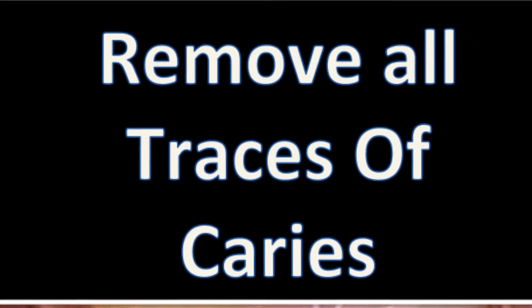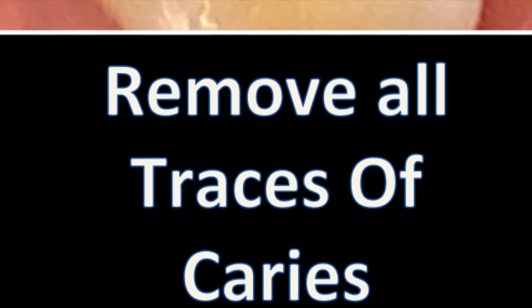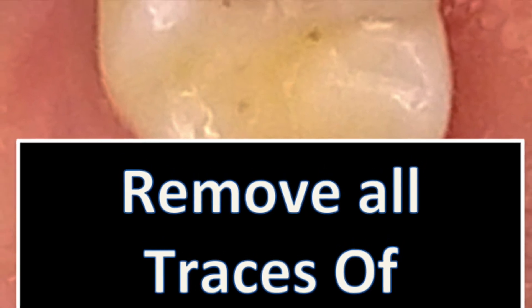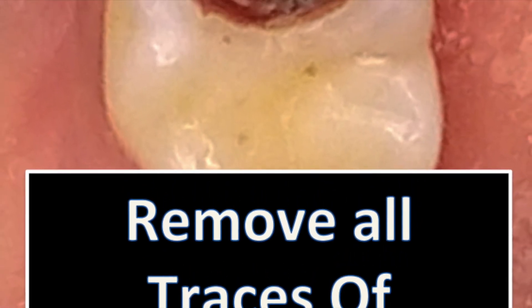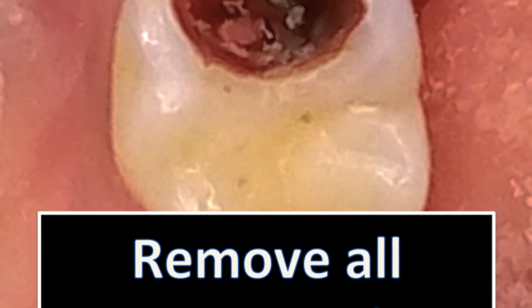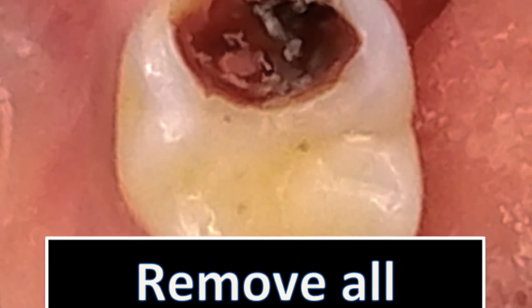Now before worrying about access into the chamber, it is prudent that the practitioner first remove all traces of active caries. If you don't do this now, there is a good chance you will forget about it the moment you get caught up with the other steps of endodontics.